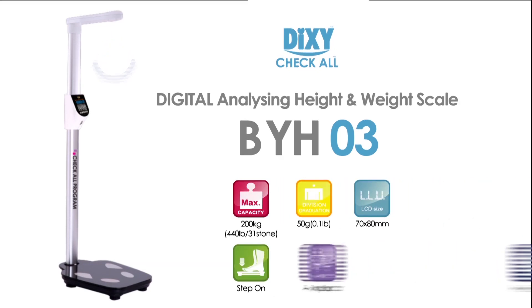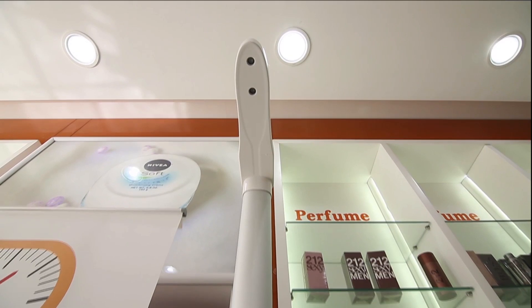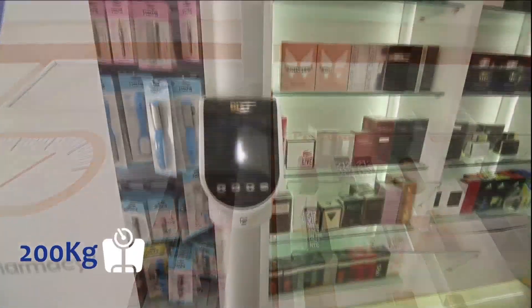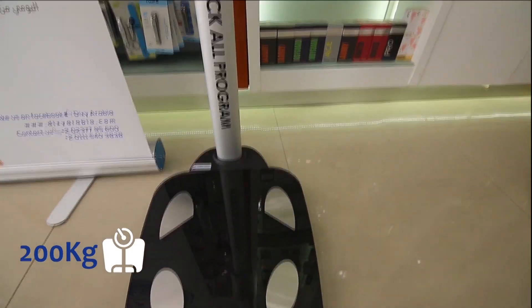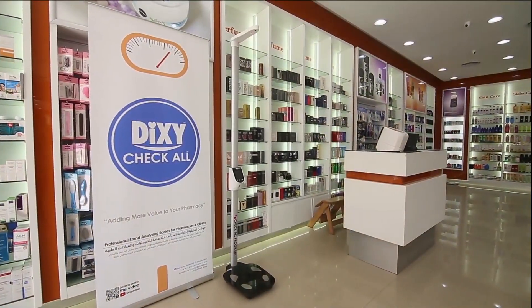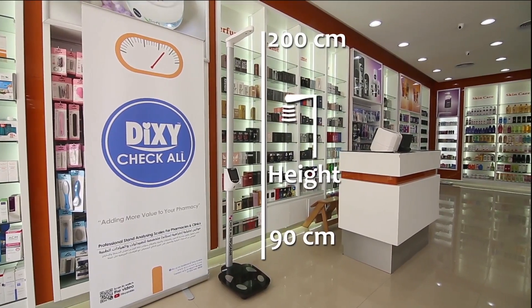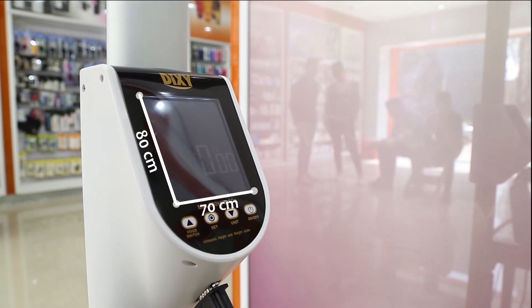Dixie Check-All BYH-03. The BYH-03 scale measures weight up to 200 kilograms with a division graduation of 0.05 kilograms. The height measurement range is from 90 to 200 centimeters. LCD dimensions are 70 millimeters length and 80 millimeters width.